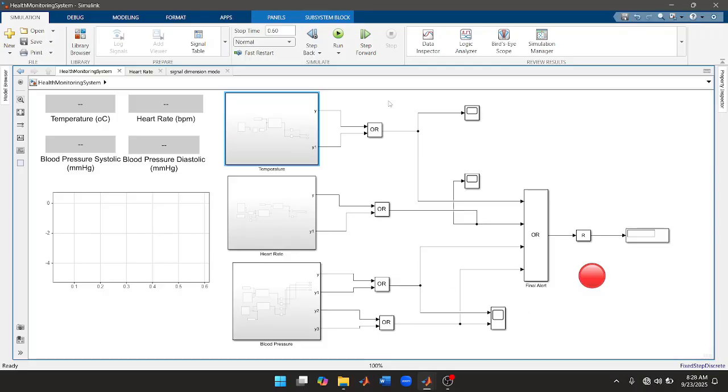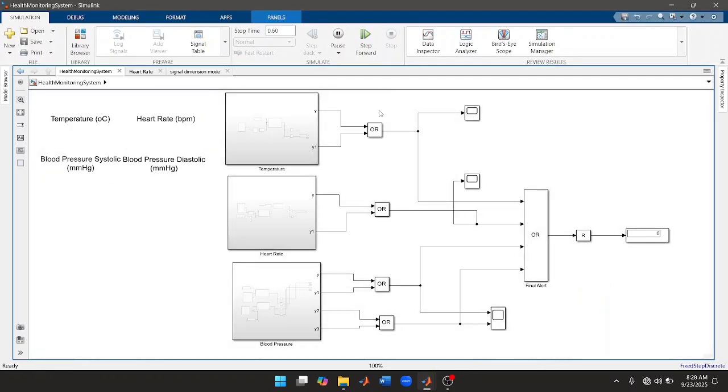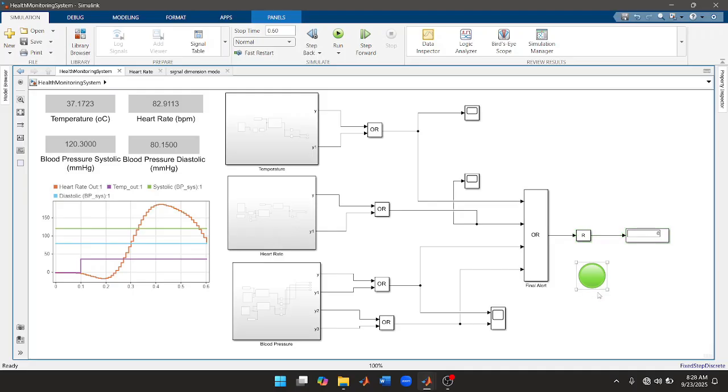Now let's simulate the system to see. First of all, we are going to simulate in the normal condition, if the patient is normal. In a normal condition, you can see that we have a green alert. It shows that the patient is normal. Now, the output is reading 0. So because this output is 0, the patient is normal. Temperature is 37, which is normal. The heart rate is 82, which is normal. We have the blood pressure 120 over 80, which is normal.